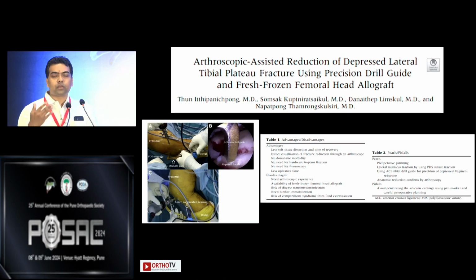One of the ways to assess where the guide wire should enter the depressed fragment is the arthroscopic-assisted jig. We use an ACL jig, which can be placed over the fracture fragment or the center when we need to pass in our elevation guide. Usually an Arthrex type jig, which is a flat jig, can be used very well.